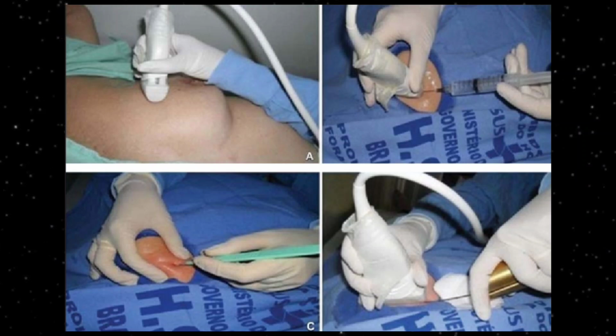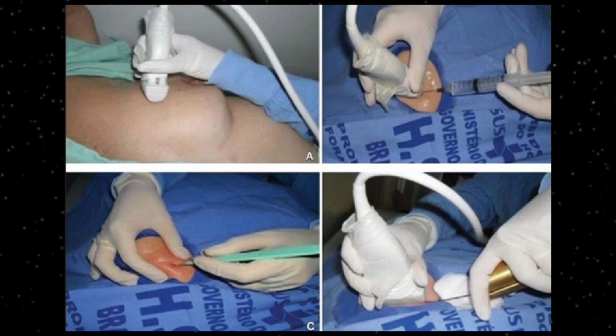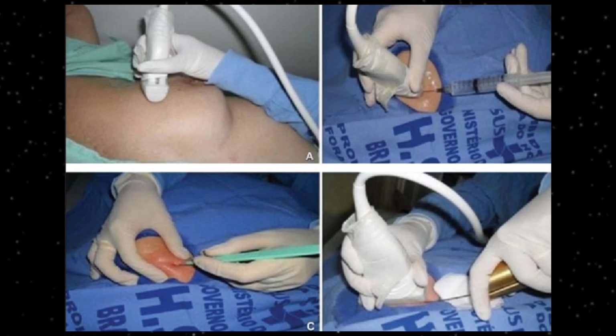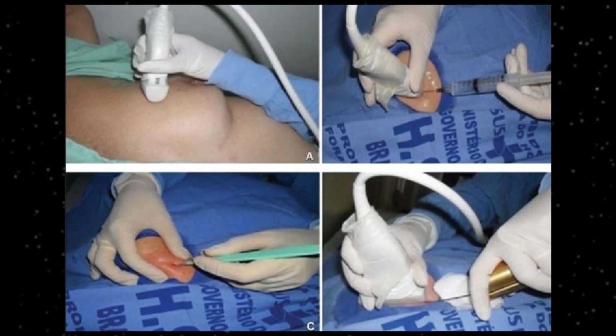After that, there is a particular needle for FNAC, or a small syringe needle can also be used, to reach the targeted lesion straight away under ultrasound guidance. Under the ultrasound guide, you can see your needle approaching the lesion, and you can easily reach the area of or within the lesion where you need to suck either the tissue out or fluid out. This can be done quite comfortably under the guidance of ultrasound imaging.